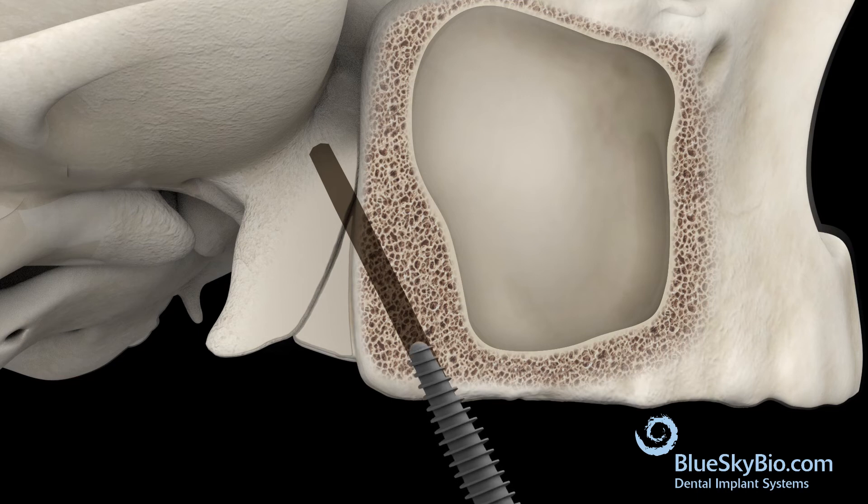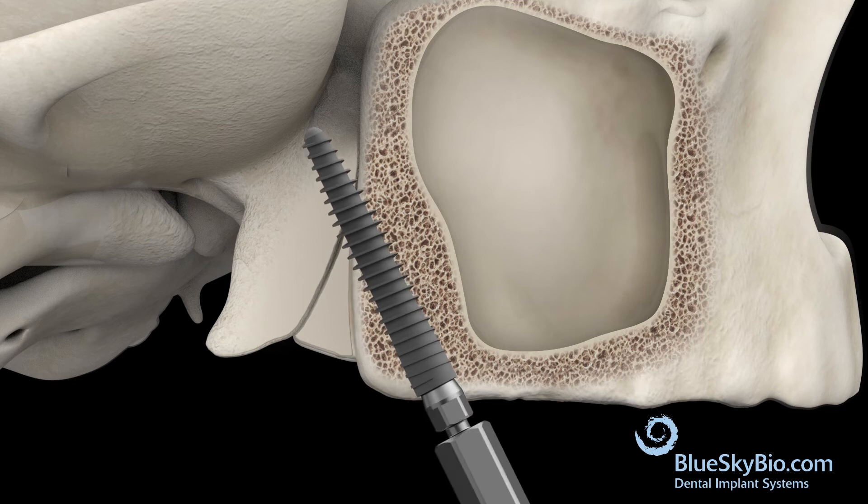Place the implant to the desired depth. To prevent bone breakage, do not over-torque. Place a multi-unit abutment on the implant.